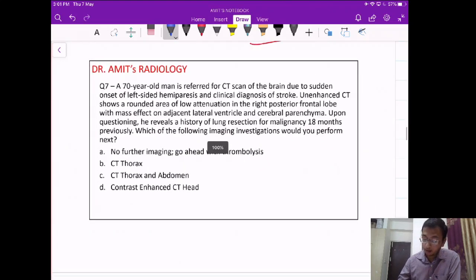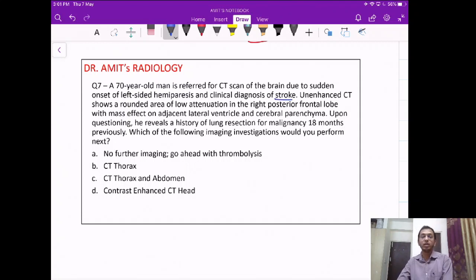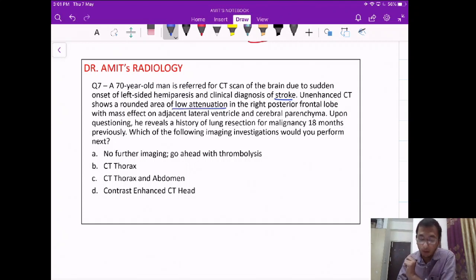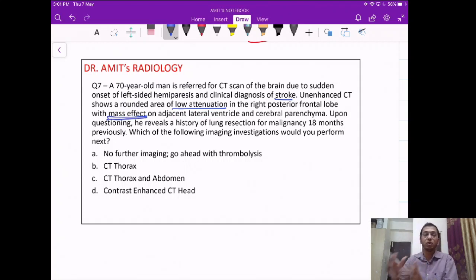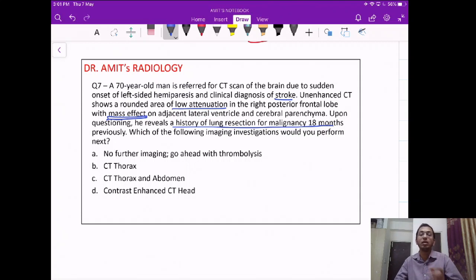Question 7: a 70-year-old man presenting with left-sided hemiparesis, suspected stroke. On non-contrast CT, a low attenuation area is seen in the frontal lobe with mass effect on the surrounding lateral ventricle and parenchyma. The patient also has a history of CA lung resected 18 months back. The question asks: what is the next step in management?